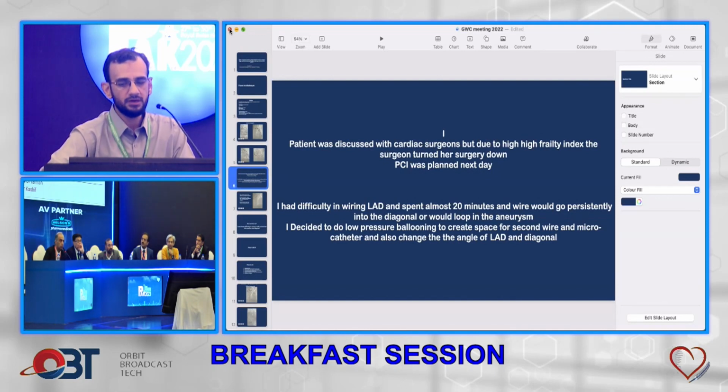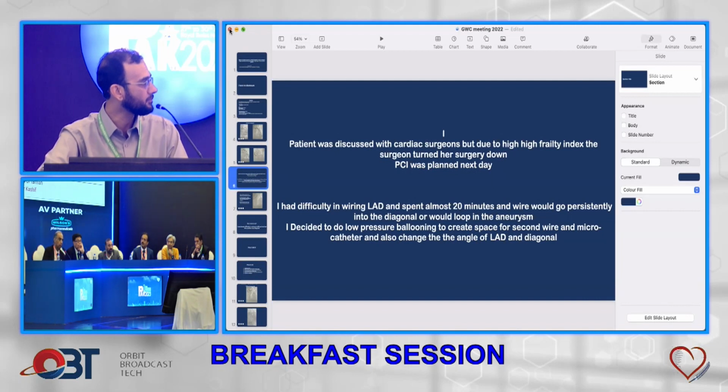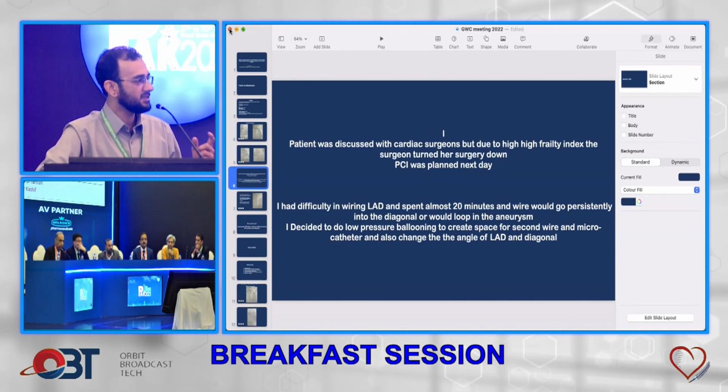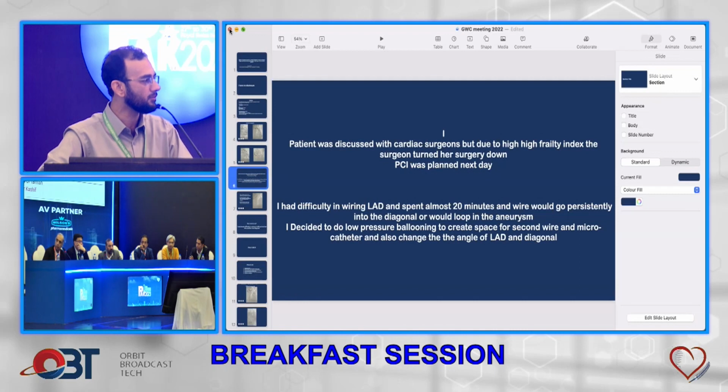A 2.0/10 balloon at 10 ATMs was inflated simultaneously with a 3.5/30 drug eluting stent from the ostium of the LAD, overlapping the previously placed mid-LAD stent. There was, however, a problem with our inflation device as well in this case. As we were trying to inflate, the inflation device dial didn't go up, but the fluoroscopic images showed good balloon dilation. We were stuck at around 4 ATMs initially, and then suddenly the dial jumped to about 12 ATMs, the pressure at which we were intending to deploy the stent. So we gave a small puff just to make sure everything was okay, but lo and behold, we had a perforation there.